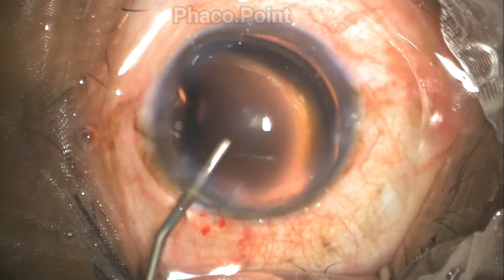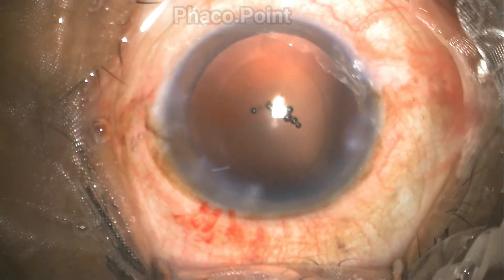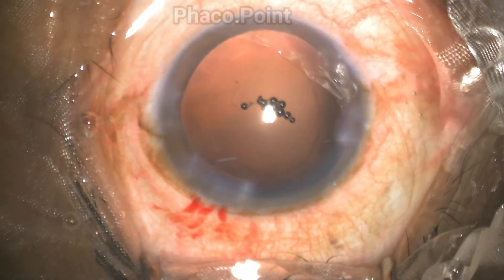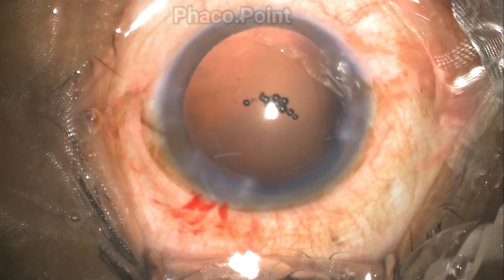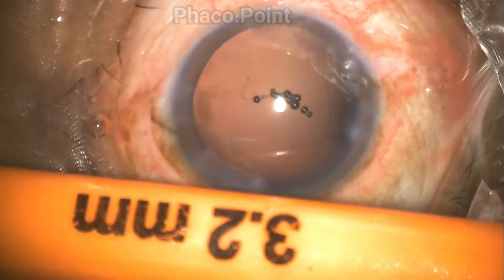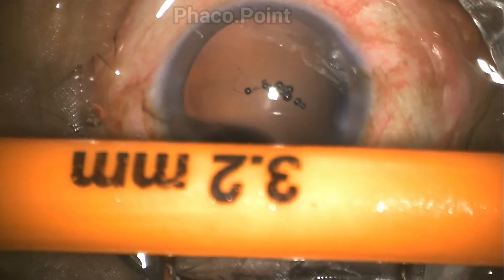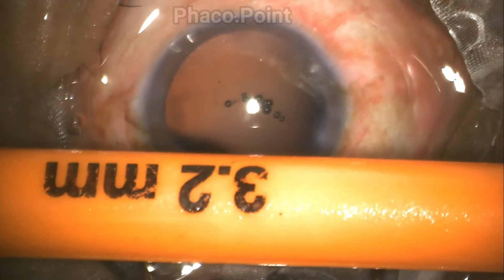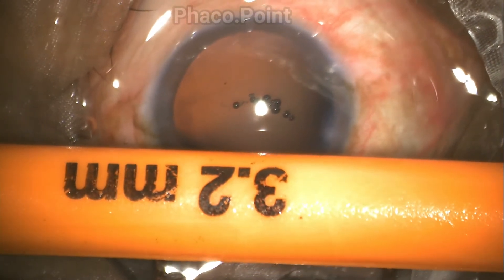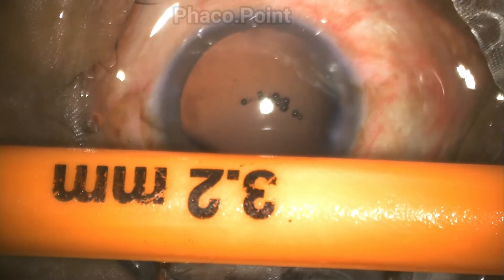At the outset of IOL insertion, ensure that you have insufflated the capsular bag and the anterior chamber with adequate viscoelastic. Don't forget you are looking at very stiff haptics which have a propensity for damaging the posterior capsule, so you want a well-insufflated bag. These lenses have stiff haptics, and that is the reason why we use a larger injector cartridge system to inject them.